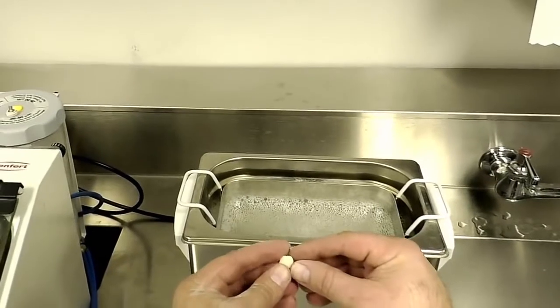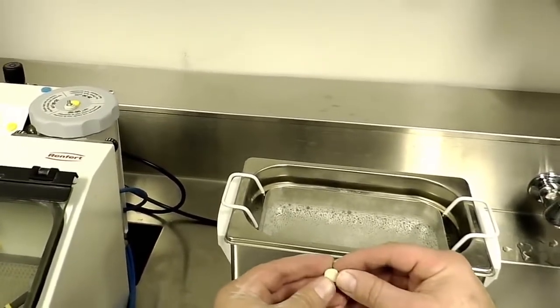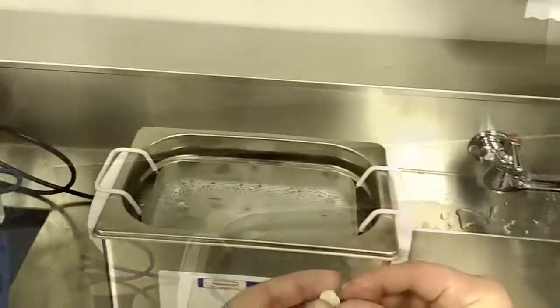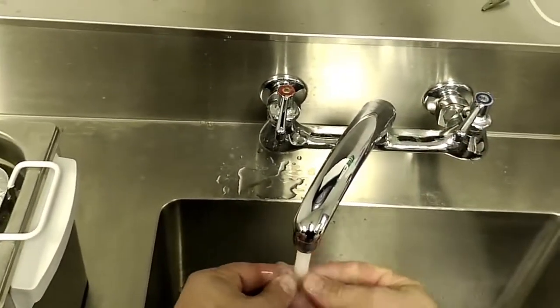At this point, we take the restoration and put it in the ultrasonic cleaner or steam cleaner to make sure we get any of the residue off. After the restoration is cleaned, we take it out of the ultrasonic cleaner and rinse off any residual liquid that might be on there.